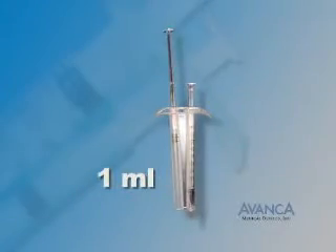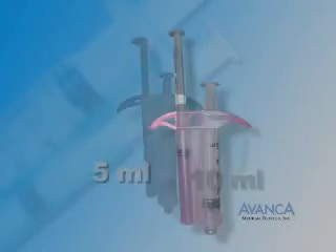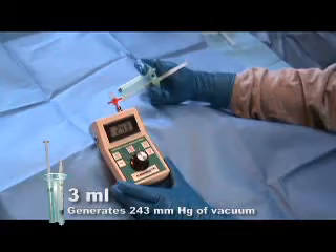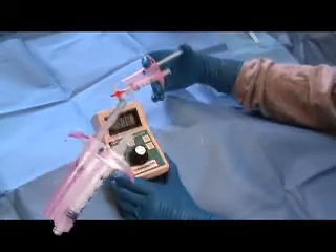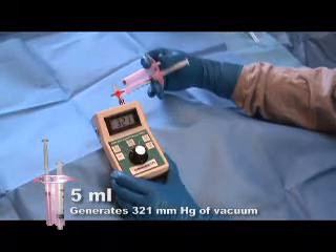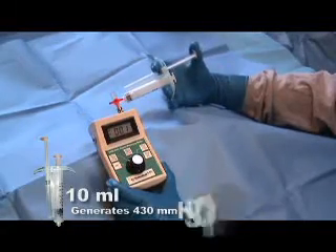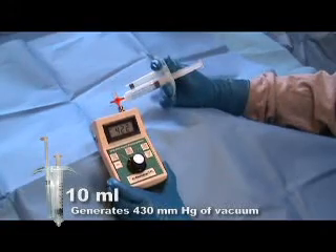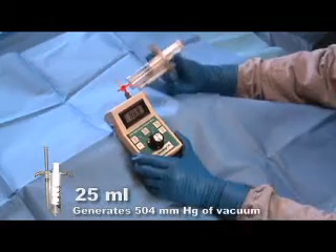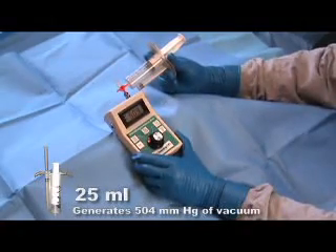Different sizes of the RPD generate different levels of vacuum and replace the corresponding sizes of conventional syringes used for biopsy. The 3ml RPD generates 243 mmHg of vacuum. The 5ml RPD generates 321 mmHg of vacuum. The 10ml RPD generates 430 mmHg of vacuum. The 25ml RPD generates 504 mmHg of vacuum.